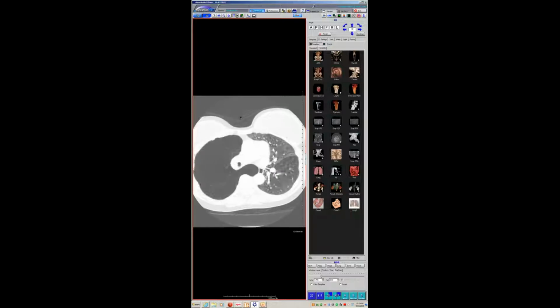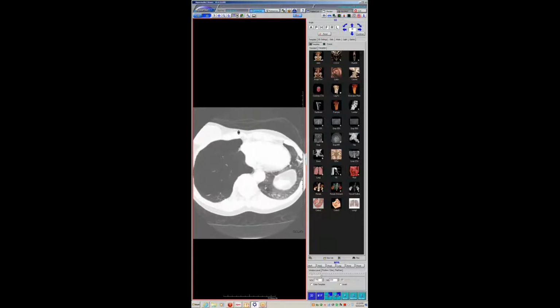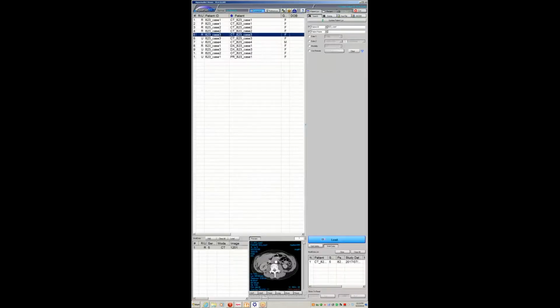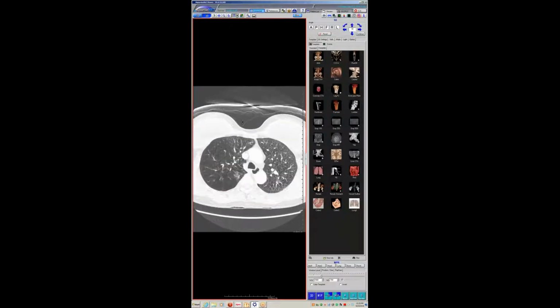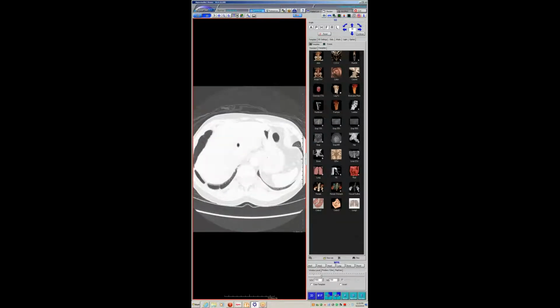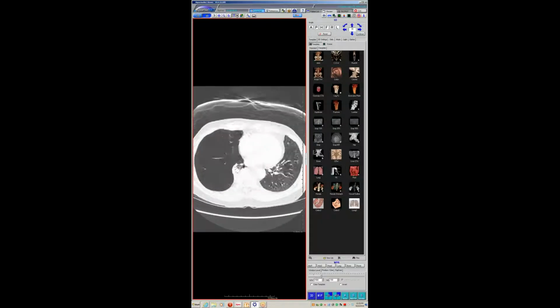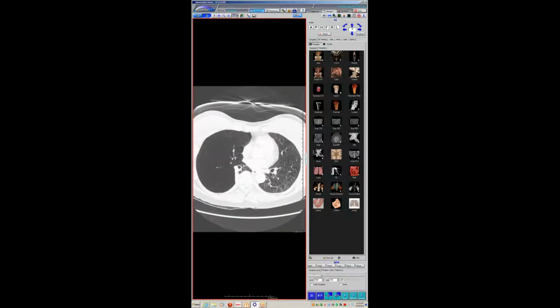I like your first thought, Seth, because I think middle lobe is one of the more common places, and the fact it's an entire lobe and it's the only lobe really, that would explain it. Yeah, because I have studies going back on her for years. This is, I think, a study with less severe emphysema, where the right upper lobe is not collapsed. And then this thing has just been growing and getting bigger. I think this is a CT from about 8 or 9, 10 years before. Do they usually continue to progress with increasing compression of the surrounding lung?